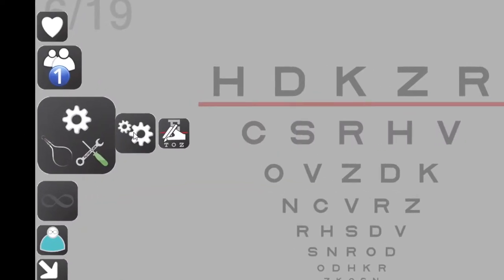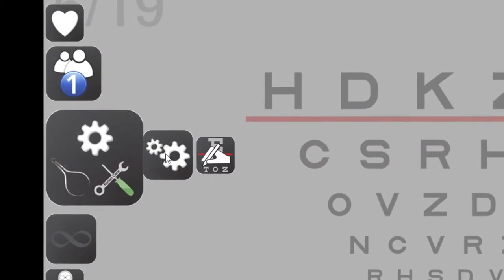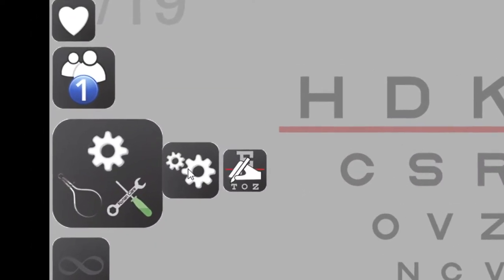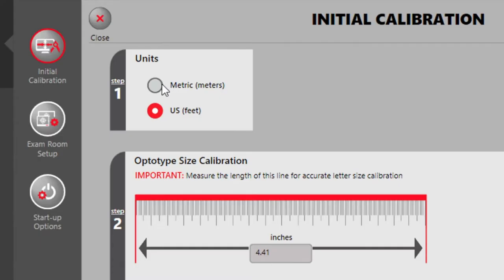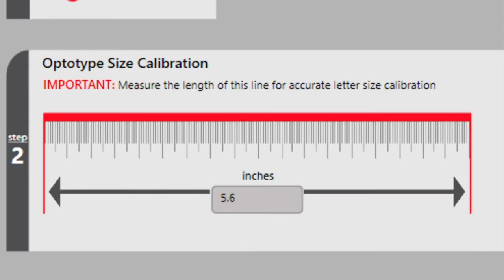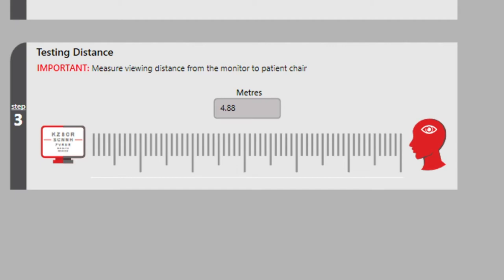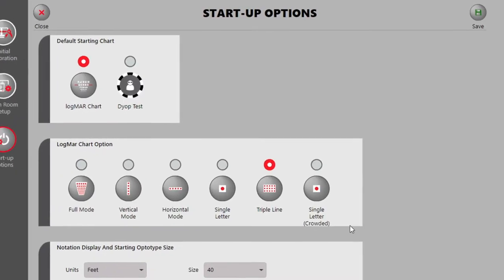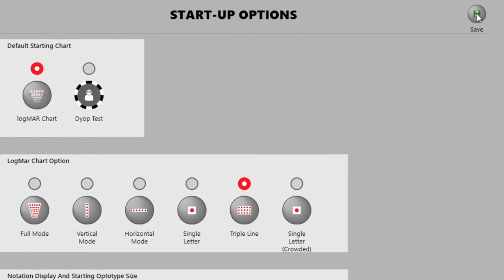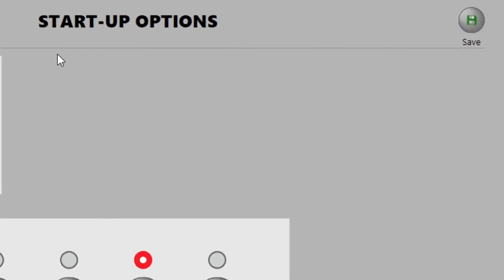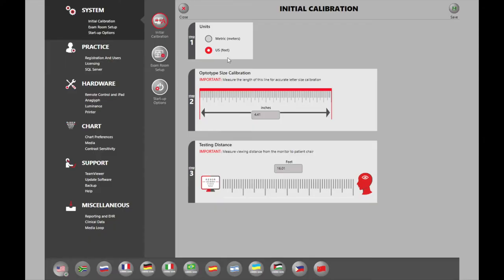To calibrate the system and ensure the correct letter height, press F10 or select the gear icon on the left-hand side menu. Measure the length of the red line in either millimeters or inches. Measure and record the testing distance from the screen to the patient's eyes. Press the Save button on the top right-hand side and you are ready to start refracting.